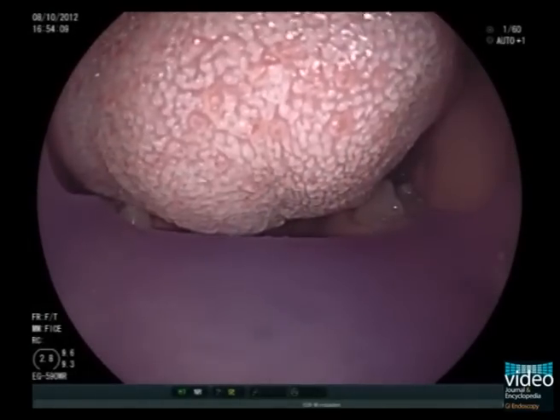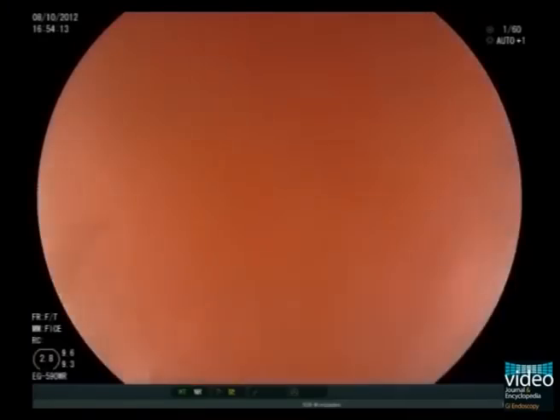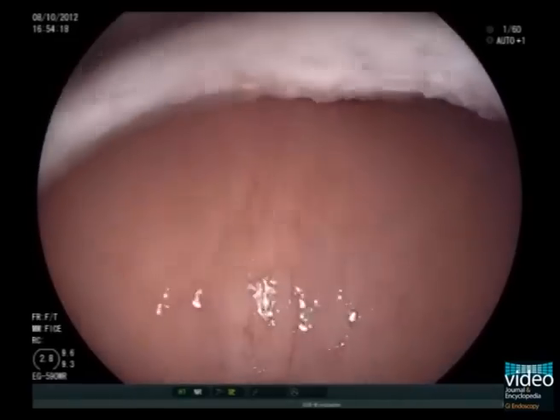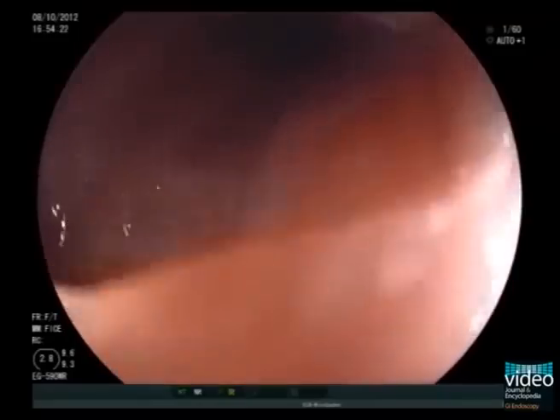We will perform upper endoscopy in a 62-year-old male patient with epigastric pain. First, put the tip of the endoscope on the patient's tongue. Under direct vision, guide the scope through the mouth. You can see the uvula at the 6 o'clock position.